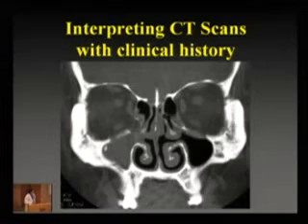And the way to interpret is very easy. If it is your patient, of course you know, but if you also get a history that the patient may have been operated on by somebody else, perhaps this is something you should bear in mind. There may be orbital penetration from before. It is not just important from the surgical aspect, but also important from the medico-legal aspect.